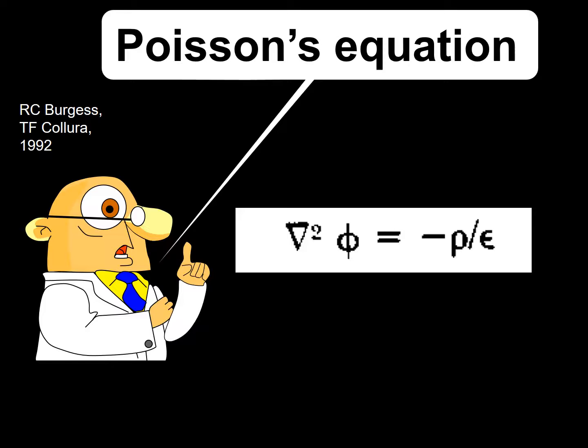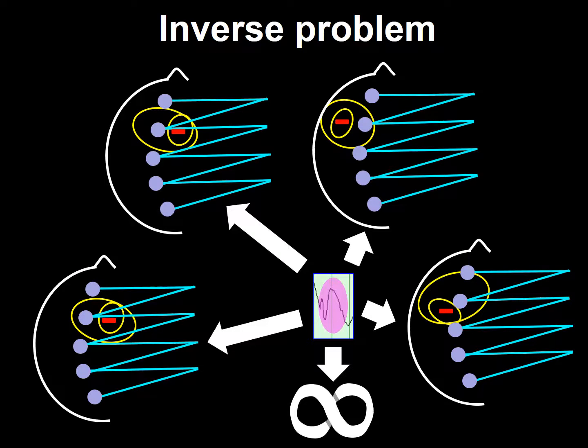It is not important for the boards that you understand the nitty-gritty of this formula. I have taken the clinical neurophysiology boards 3 times and passed them, thank God, without knowing the nitty-gritty of this formula. But it is important that you understand the general concept and its implication. Being as it may, the forward problem is not what the electroencephalographer faces every day. It is the inverse problem, what we have to wrestle with on a daily basis.